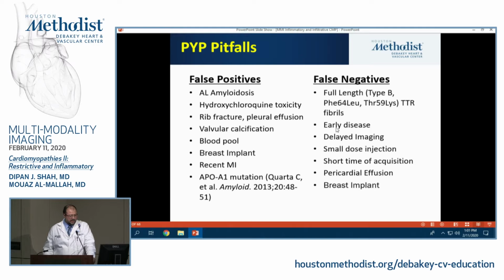Now, false negatives: early disease, or if we waited too long until a lot of the counts have decayed, so no one has been waiting more than 3 hours.